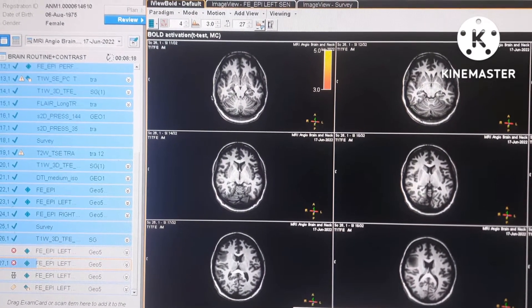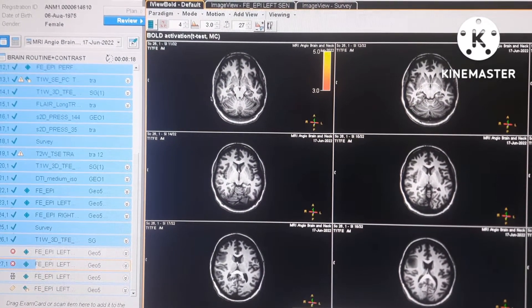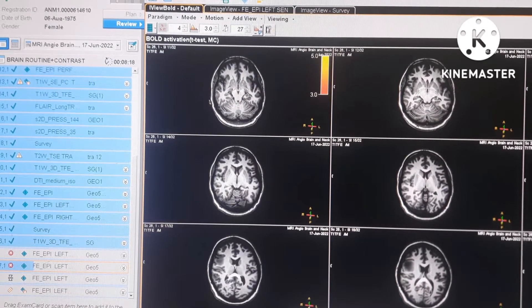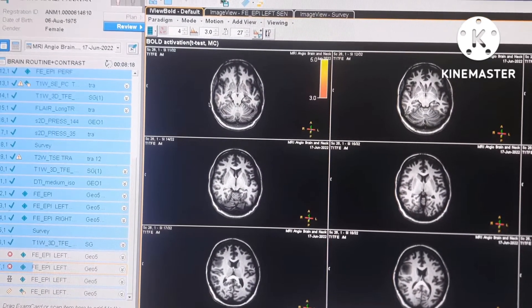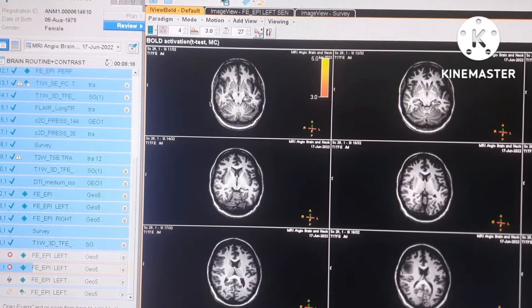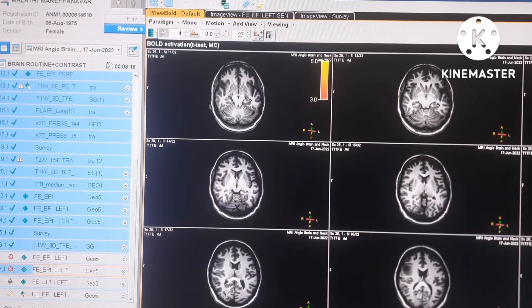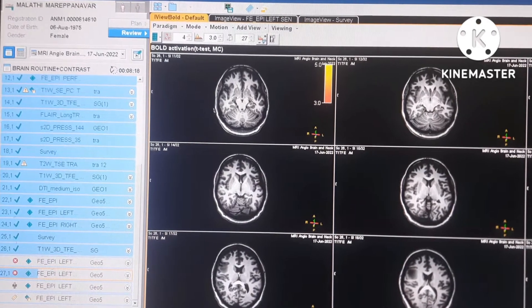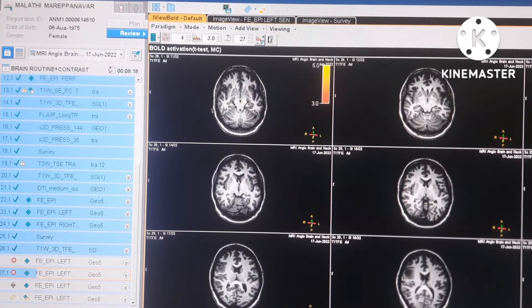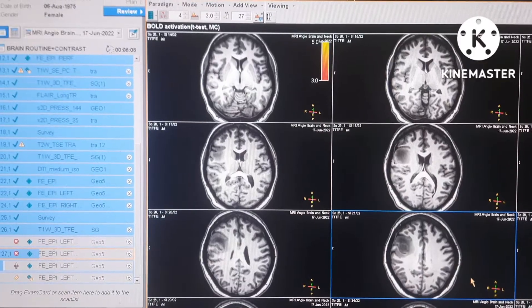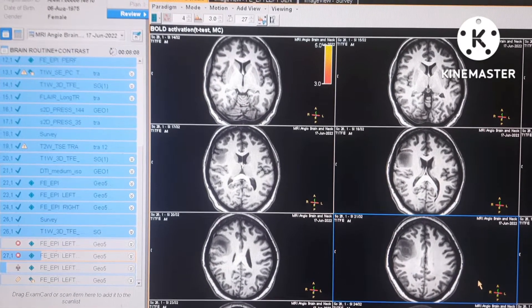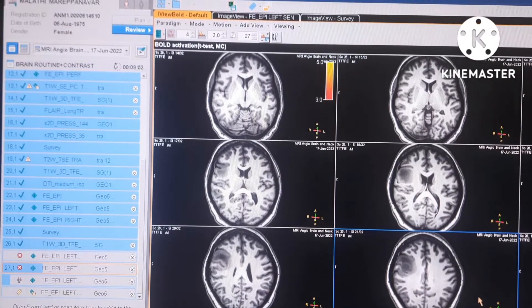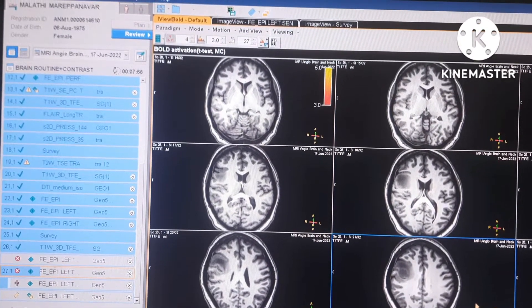We are performing functional MRI for the left hand. The patient has a tumor in the right parietal lobe, so we have to do functional MRI. We already conducted MRI with vein contrast. Before taking functional MRI, you have to take T1 3D and load it on review.